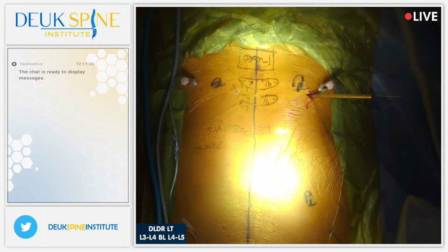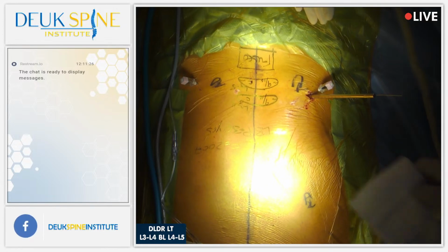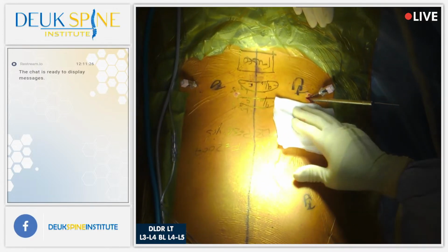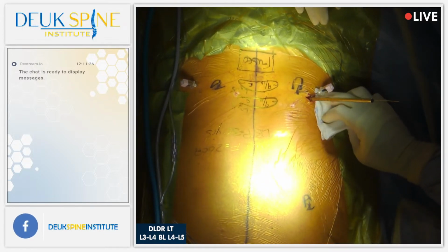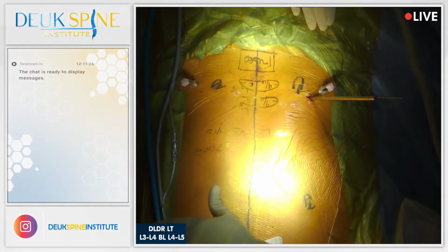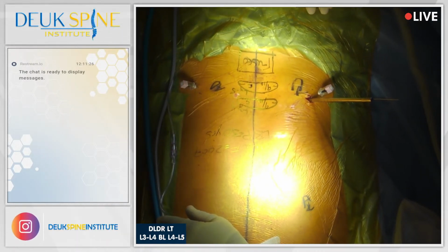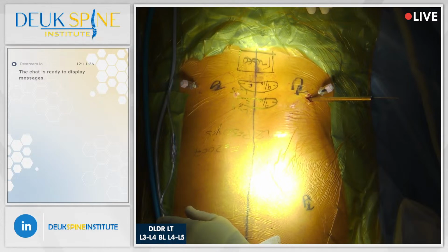That's going to hurt. It's medicine going in your vein. Why is it taking so long to get the propofol in? Did it just start going in now? Oh, okay. I have no problem with slow, but the pain starts when you start injecting the medicine, which I was wondering why there was a delay. Keep going. You're doing great.